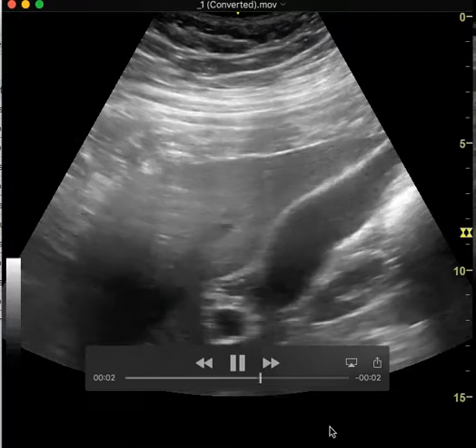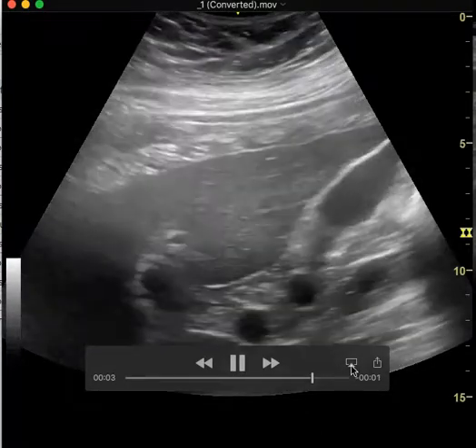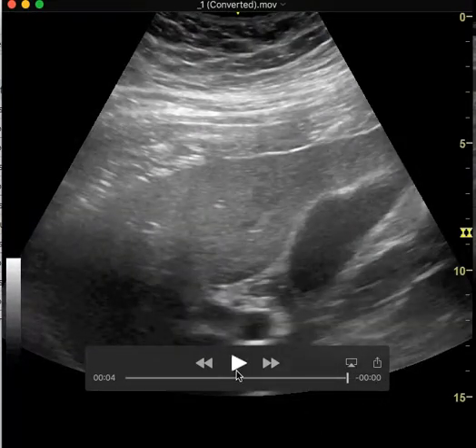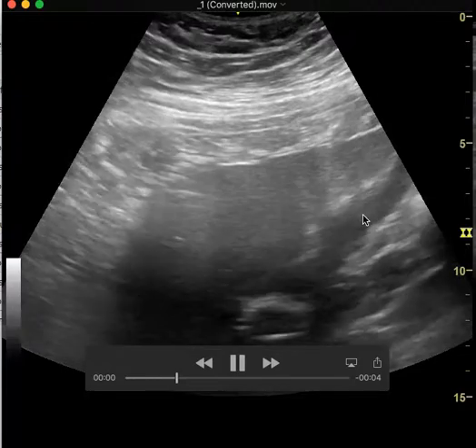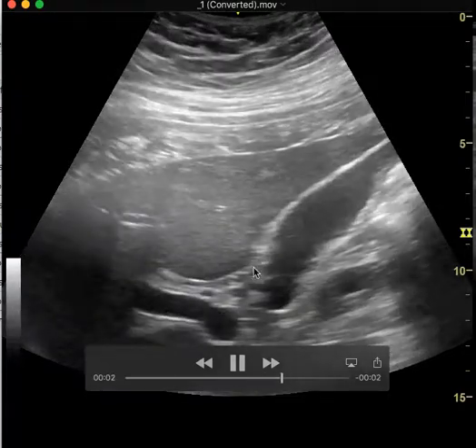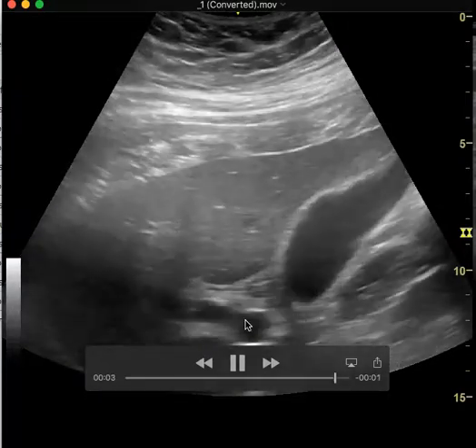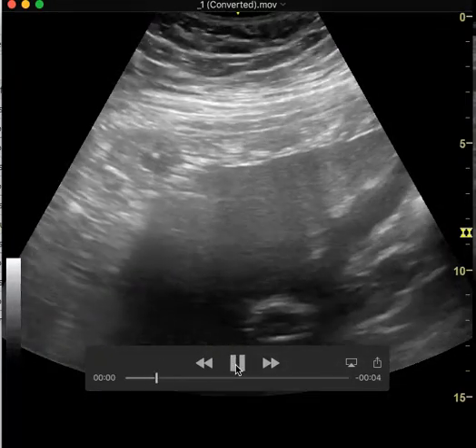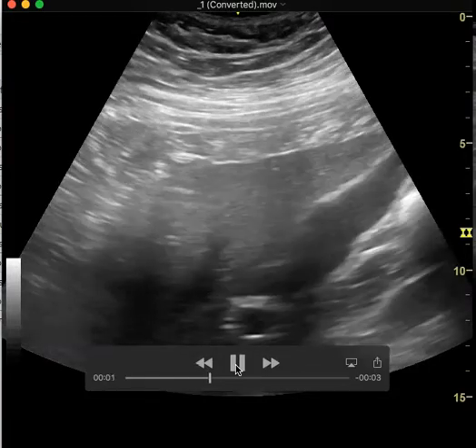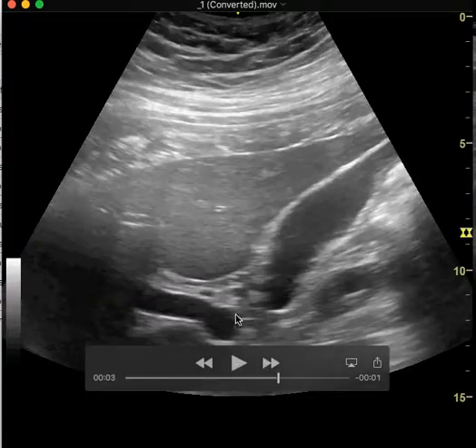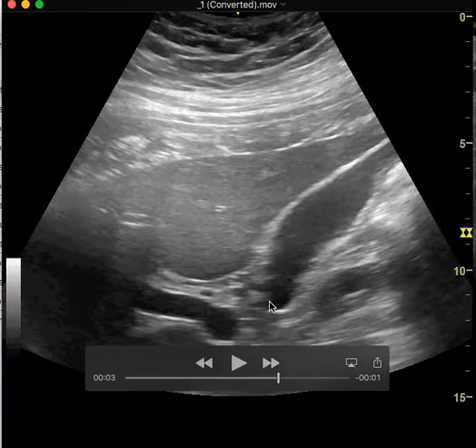This is a gallbladder ultrasound and this is a really nice clip. You can see the gallbladder to the right of the screen. You can see the portal triad right here with the portal vein, the hepatic artery, and the common bile duct. You can see them right here.